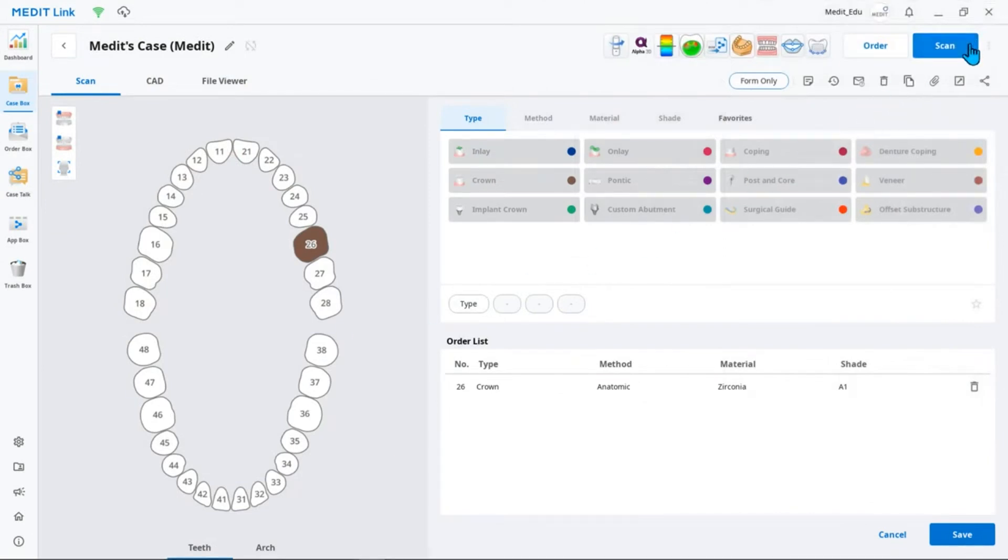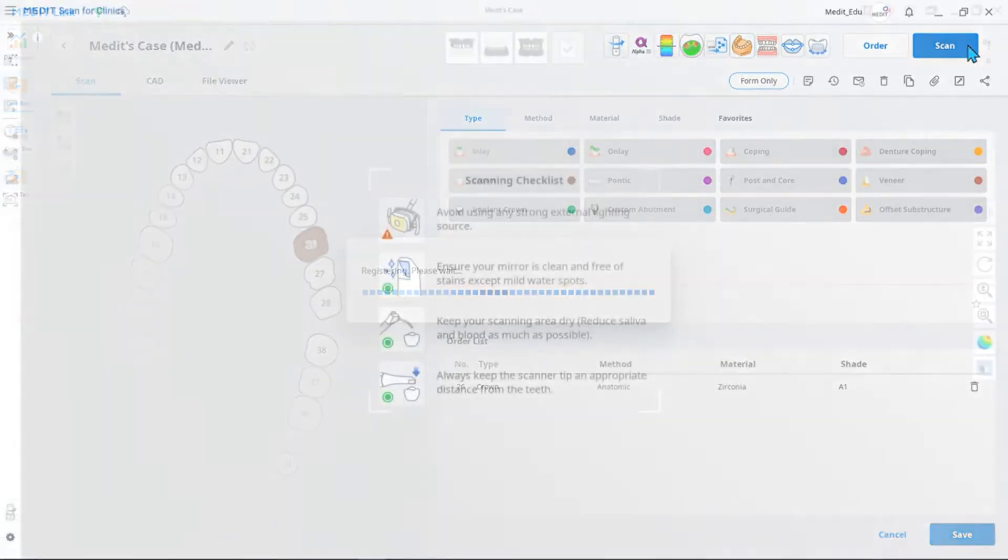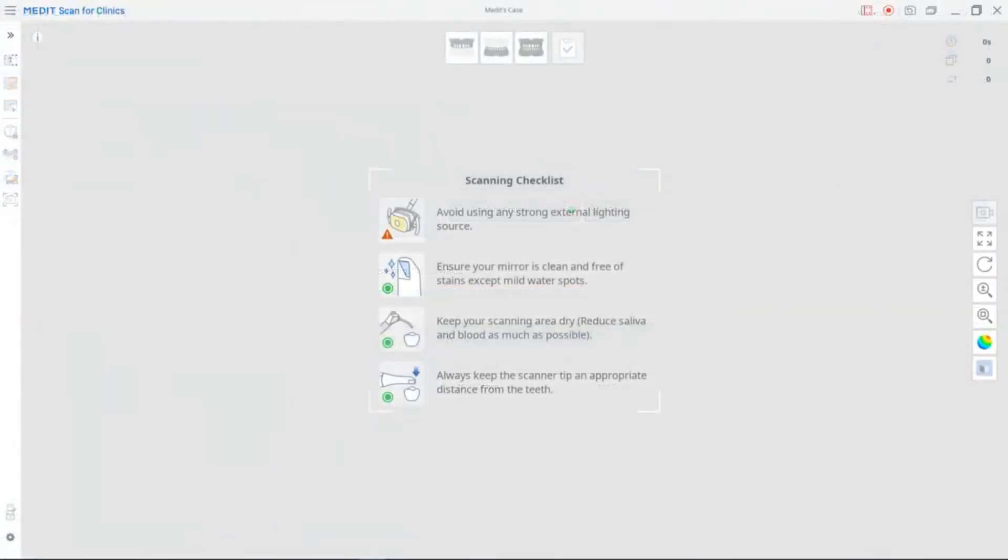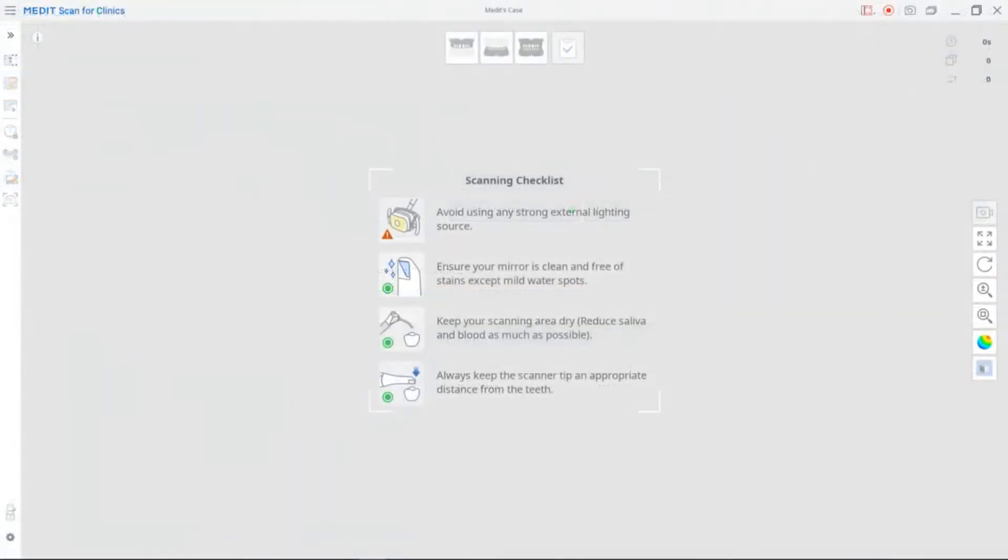When the form is completed, click the Scan button in the upper right corner to proceed. Then, the MeditScan for Clinics will appear.